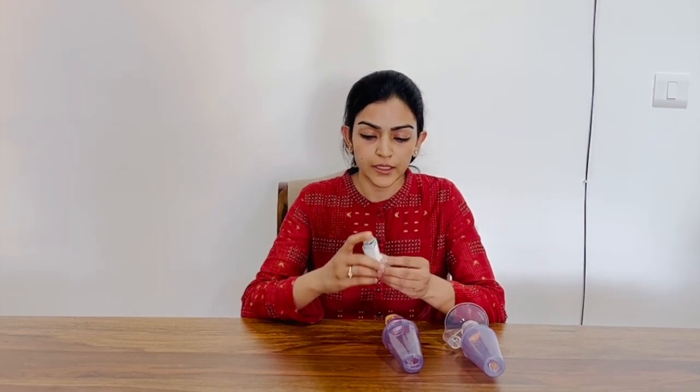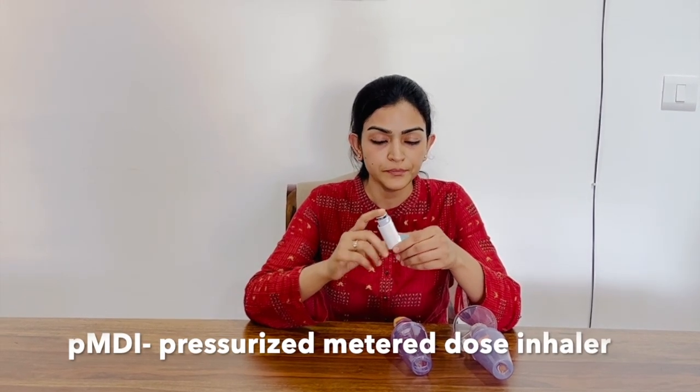So once your child is started on an inhaler for asthma or wheezing, you expect to see some improvement in your child's condition. But one of the commonest reasons for poor response to treatment is incorrect use of an inhaler. So this is an inhaler which your doctor may refer to as a PMDI or a pressurized metered dose inhaler. It is called pressurized because the medicine is stored in this canister under pressure. It is metered dose because every time you puff the inhaler, a fixed amount of dose is going to come out. So if you have an inhaler of 100 microgram, each puff will release 100 microgram of the dose.